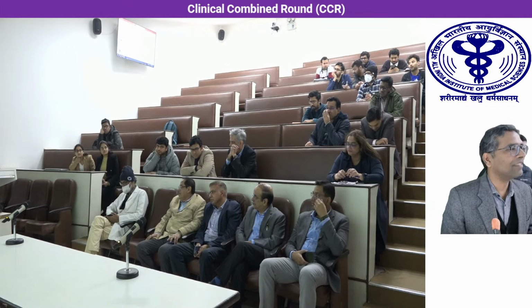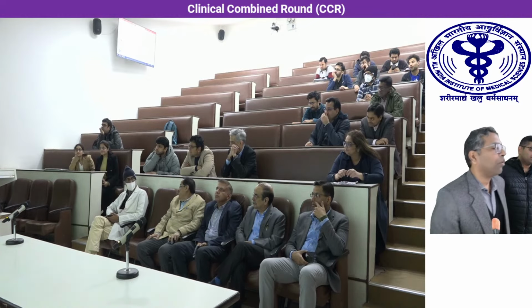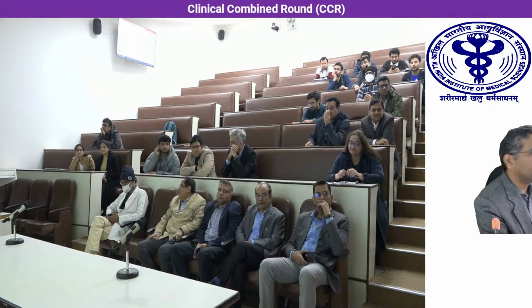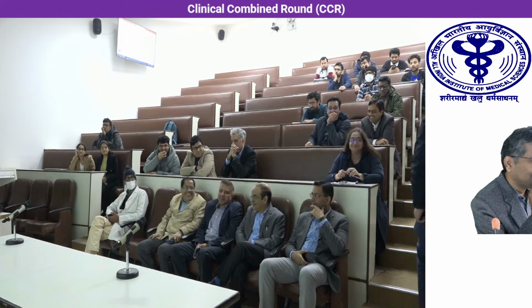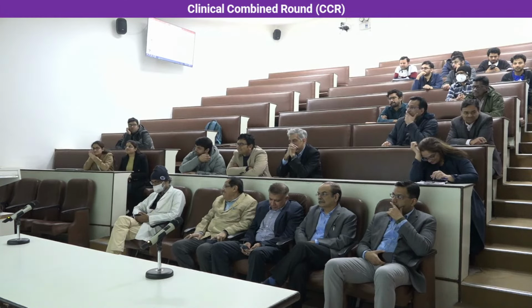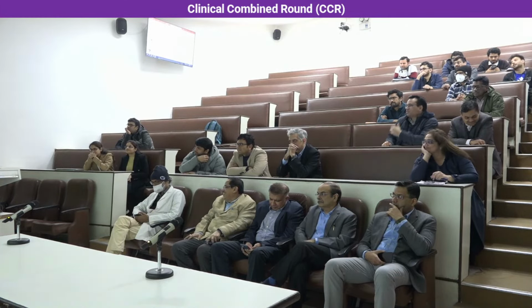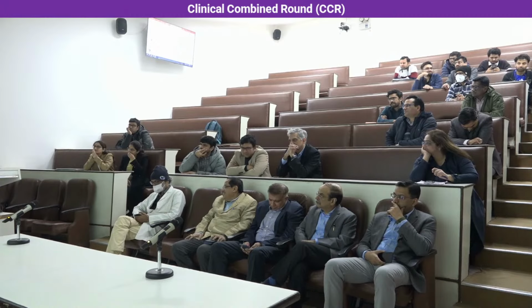Second question: is 70% R0 resection acceptable to the surgeons? Because this is such a small tumor, you would expect 95, 98% success. For a T1A tumor, R0 resection at 70%, is it acceptable to surgeons? The issue is that not every duodenal NET will progress to neuroendocrine carcinoma. Also, for a small lesion, doing a surgery, a duodenal surgery, is more morbid.